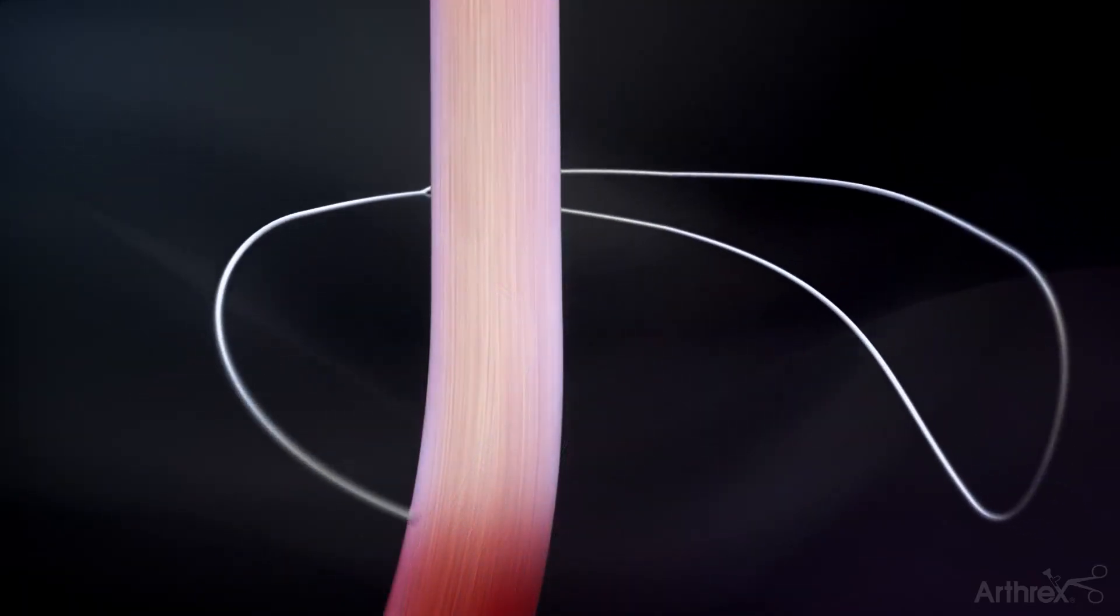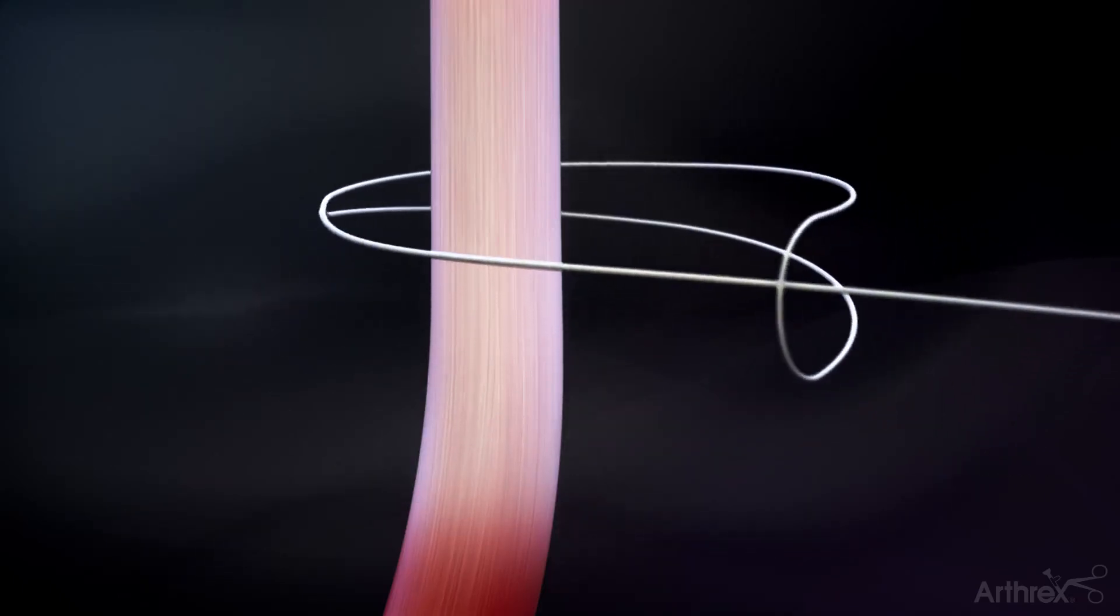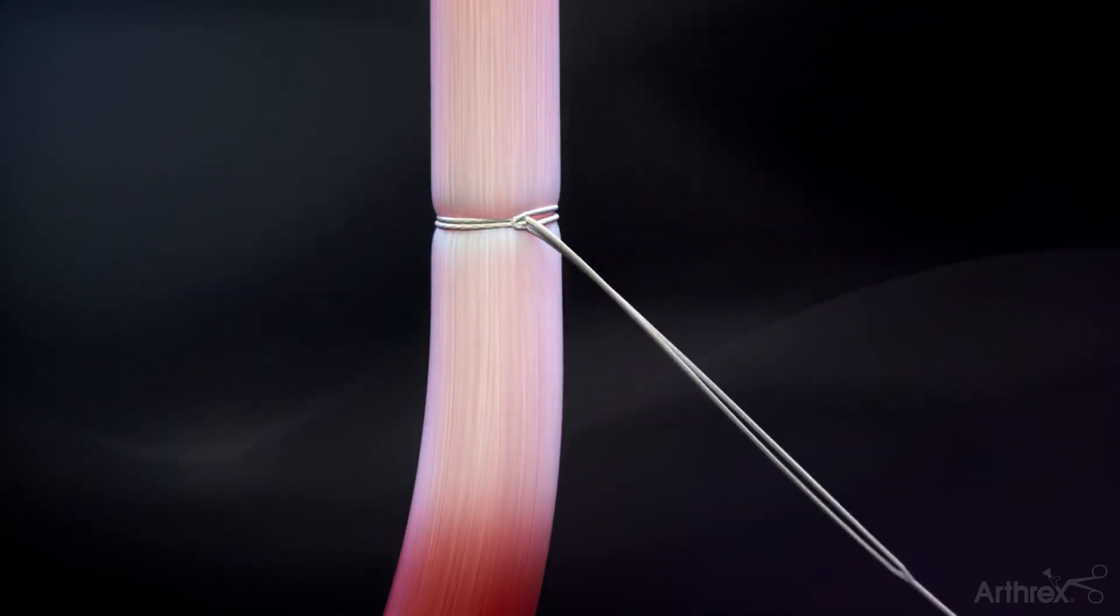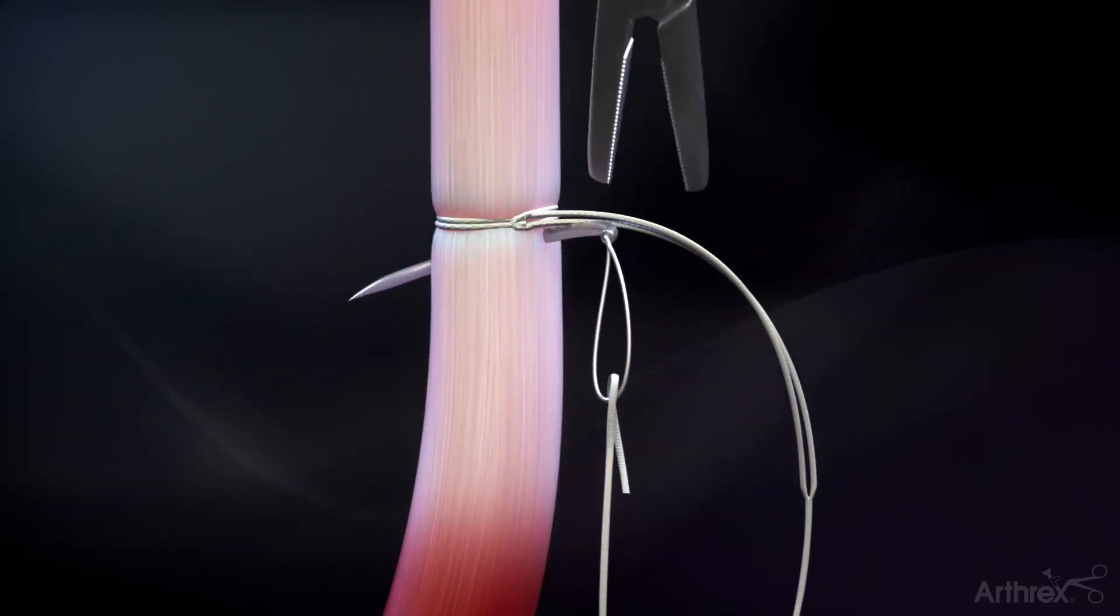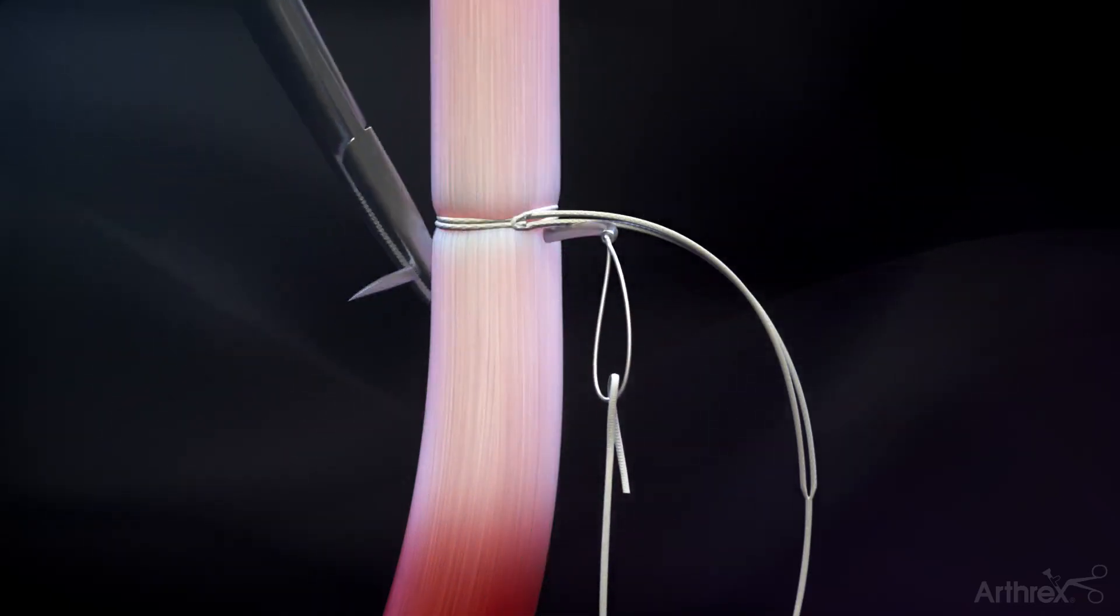Create a loop and tack whip stitch by cinching the No. 5 fiber link around the tendon, approximately 2 centimeters from the musculotendinous junction, and then passing the tail through the tendon, distal to the loop.